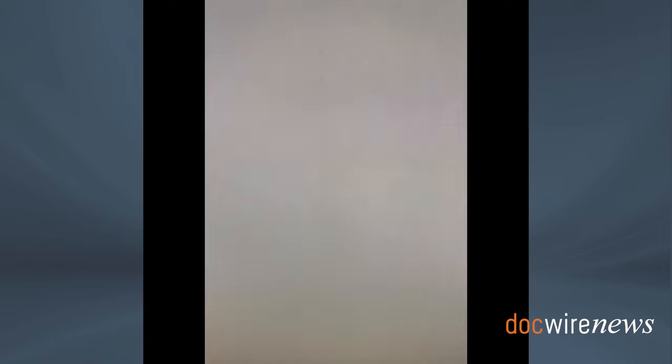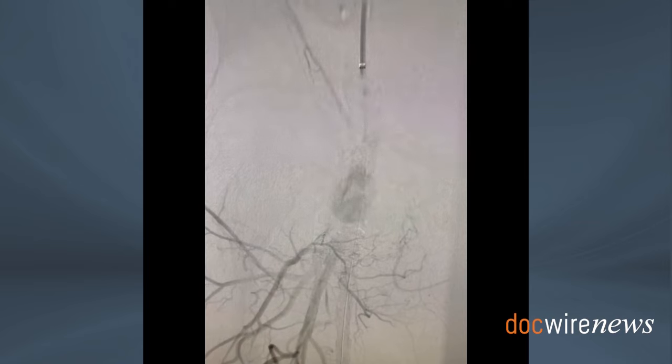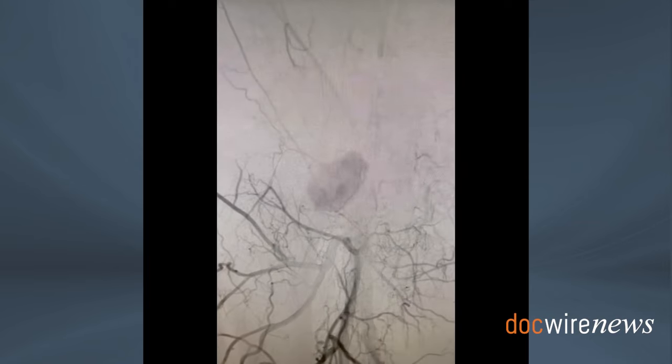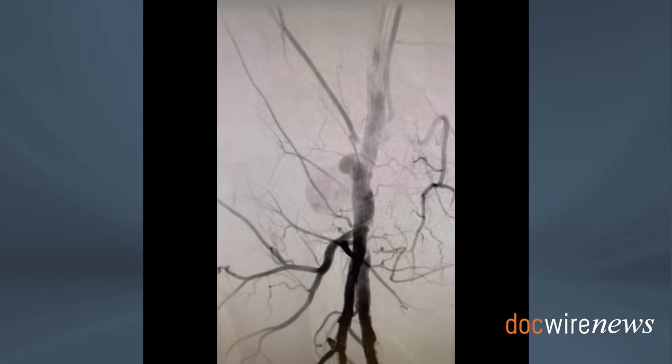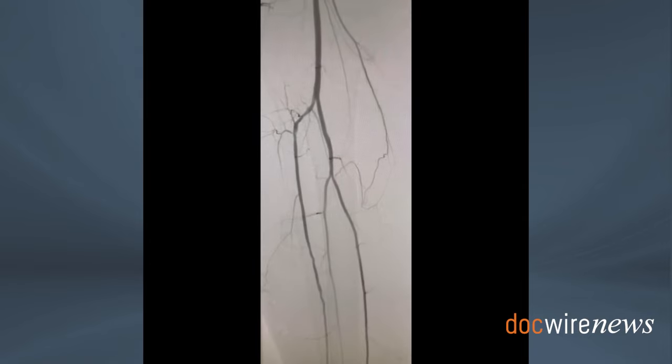The neck of the aneurysm is the most important aspect, and the smaller the neck, the more amenable to percutaneous closure. As you see here, the angiogram is performed with an up-and-over technique. A runoff is performed at baseline to make sure we have a very clear idea of the anatomy.